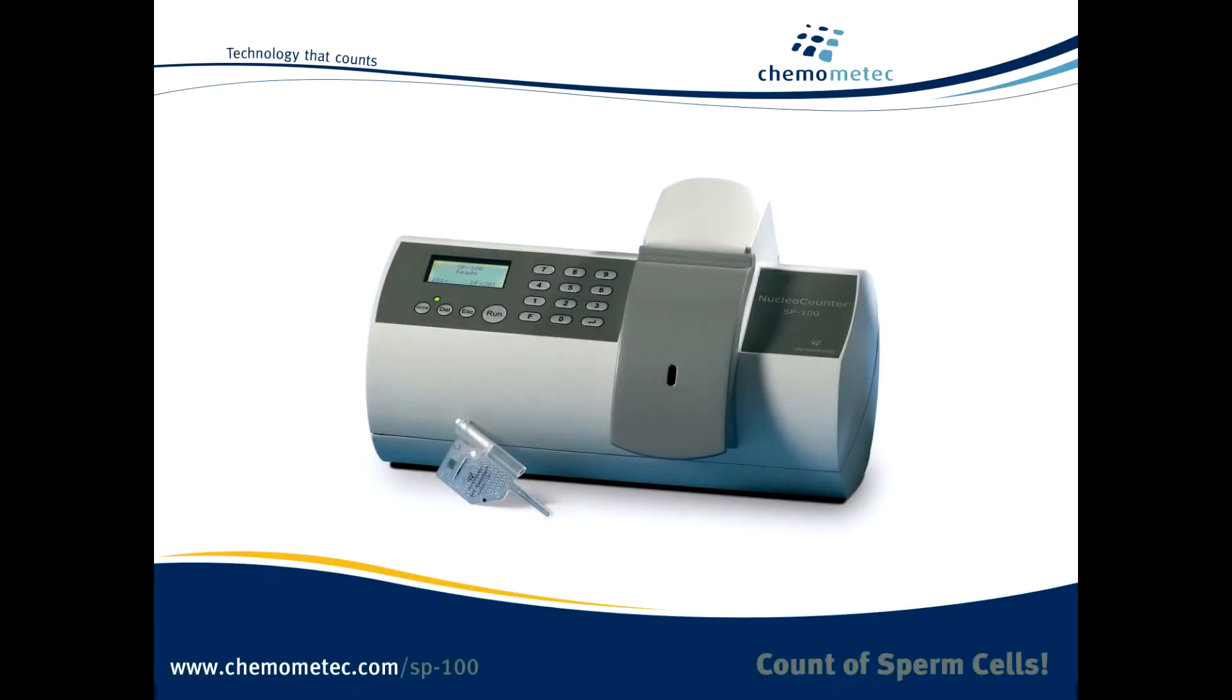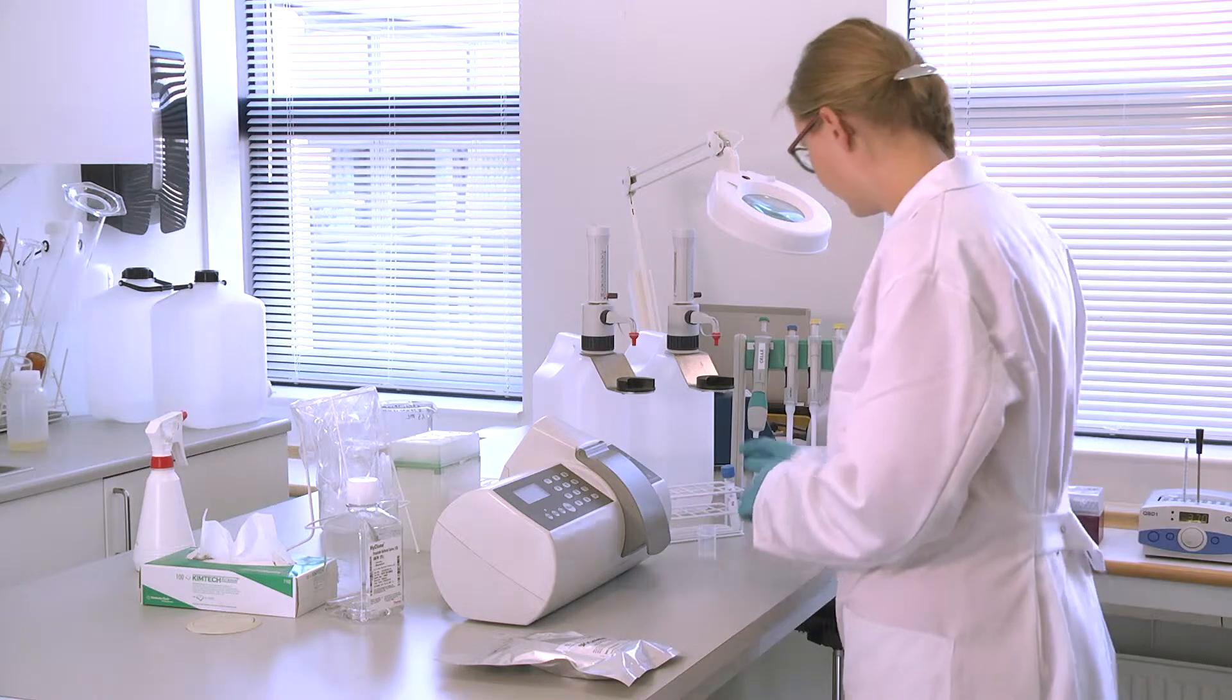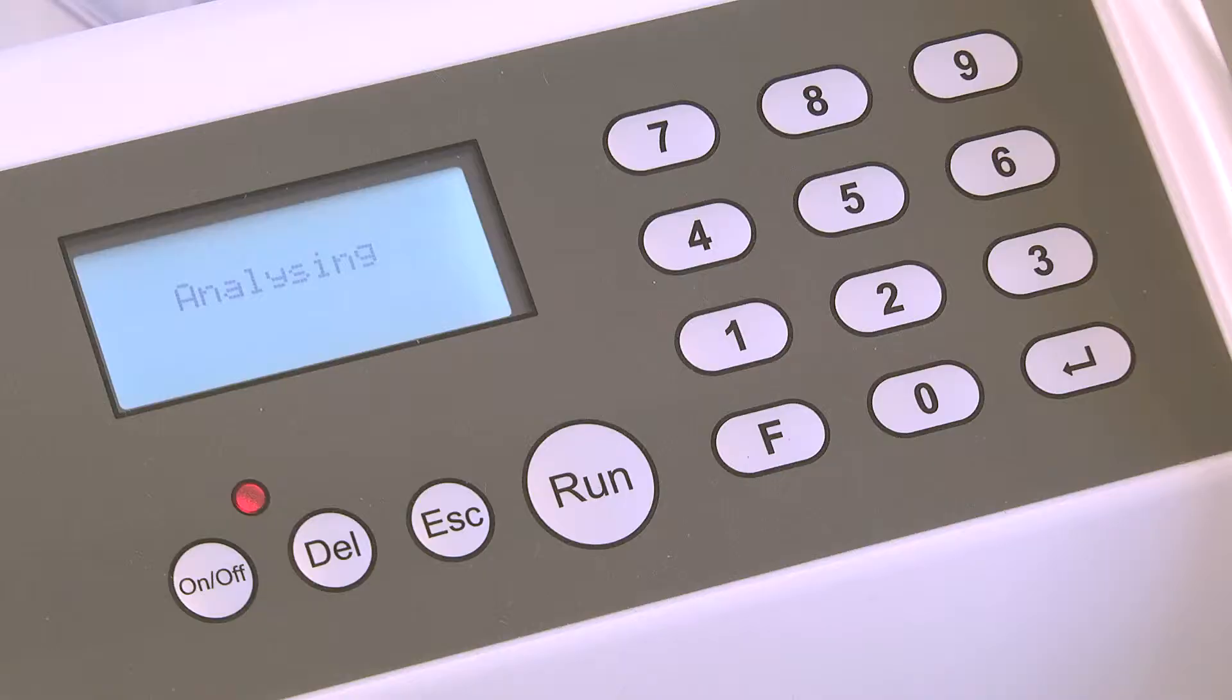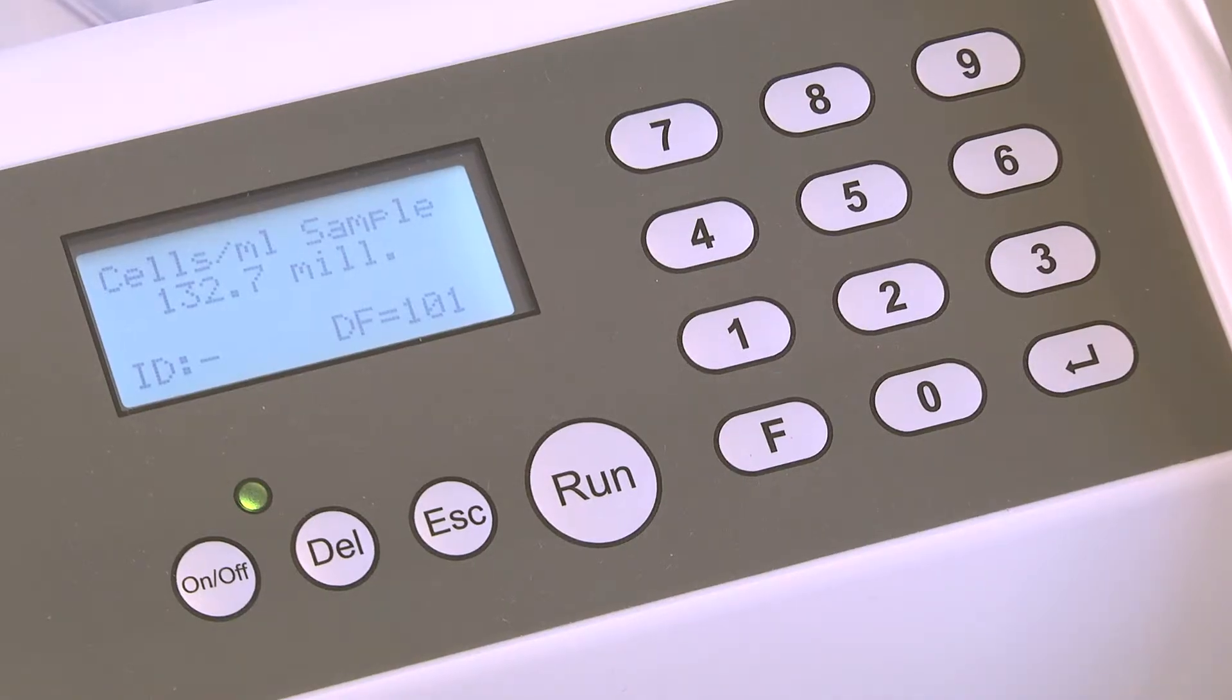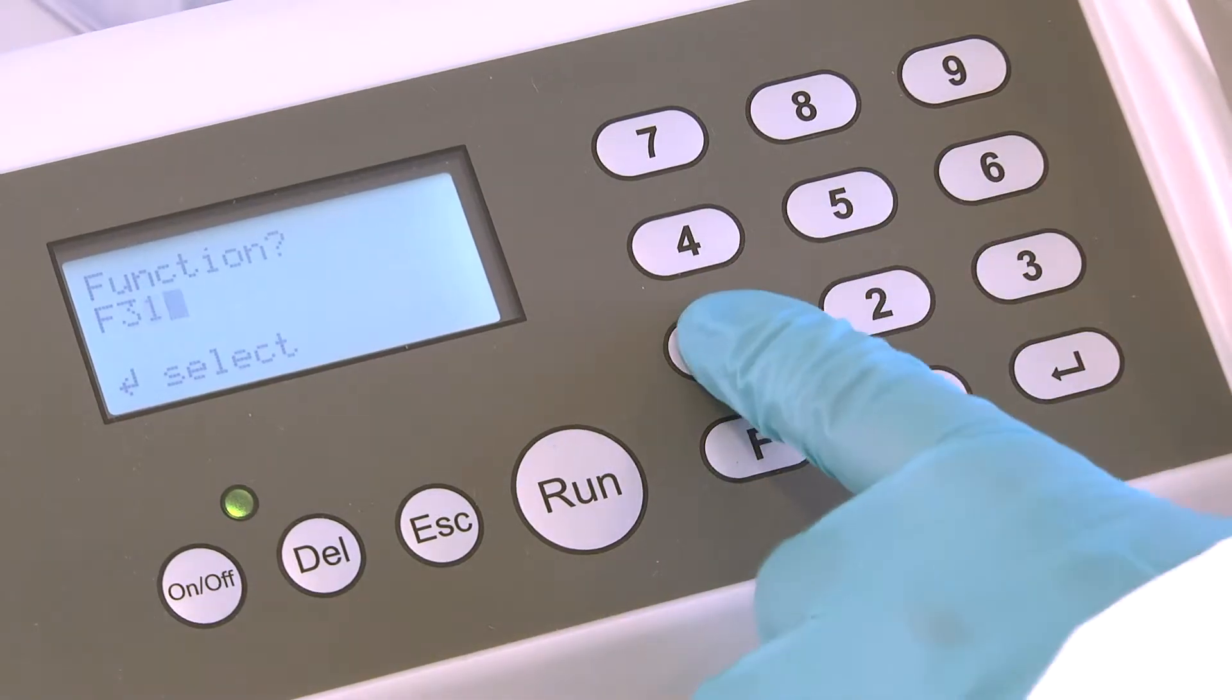The Nuclear Counter SP100 is the world's easiest semen counter. It provides the total sperm cell count in 30 seconds and measures percent viability as well.